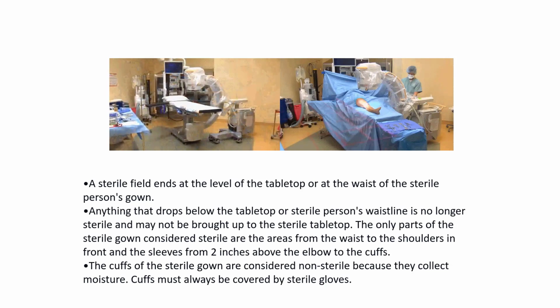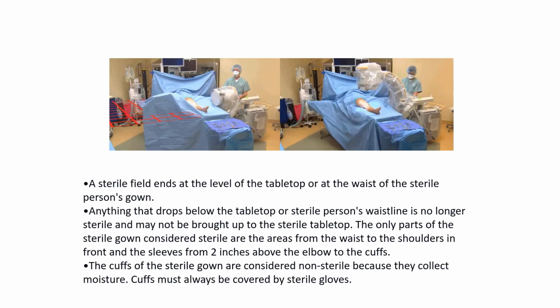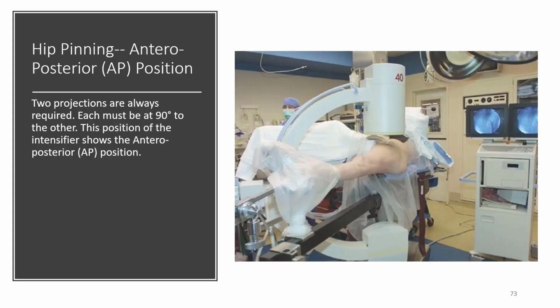When working with the staff, the radiographer must communicate or explain and demonstrate how to drape the equipment for sterile technique. I can't emphasize enough how important it is for the radiographer to understand the type of exams that they are going to participate in and their role in that examination. You need to be able to understand what you're doing, how you're doing it, and why you're doing it, which means you need a knowledge of the different types of surgery and how imaging is used in those types of surgery. So we'll take a look at some here.